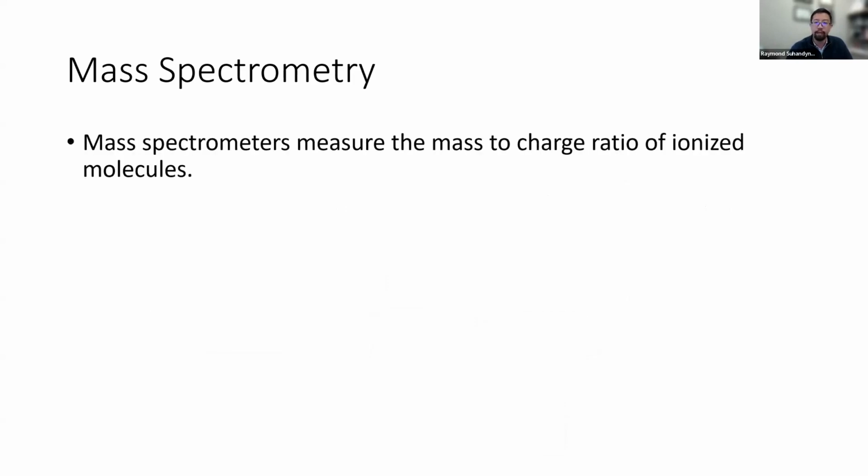As I mentioned earlier, mass spectrometry is by far and large the preferred detector. There are other detectors that you could use, but mass spectrometry gives you specificity and sensitivity. And something that I like to remind everyone is that mass spectrometers measure mass to charge of ionized molecules in the gas phase. Generally speaking, small molecules such as drugs are charged only once, but if you are working on biologics like antibodies, for instance, they become multiply charged. So just remember it's mass to charge and not actual mass.